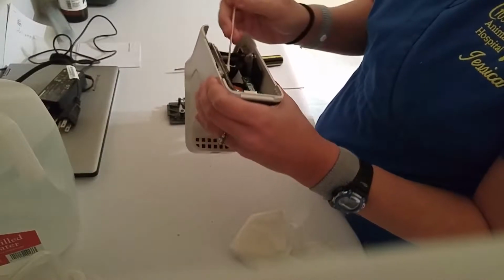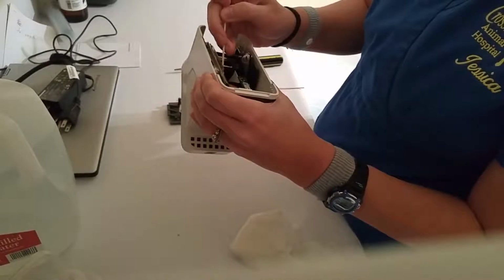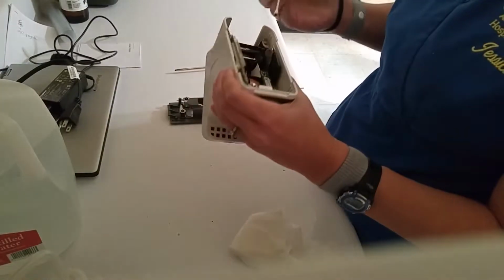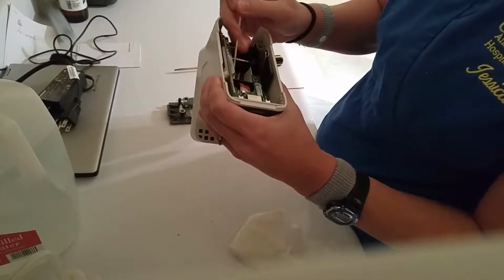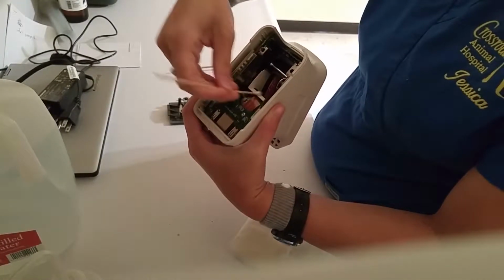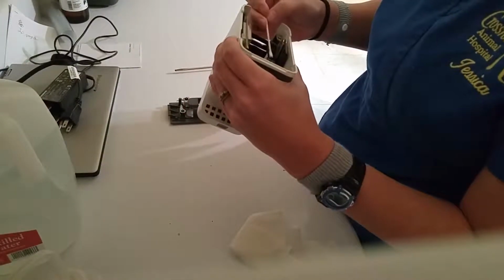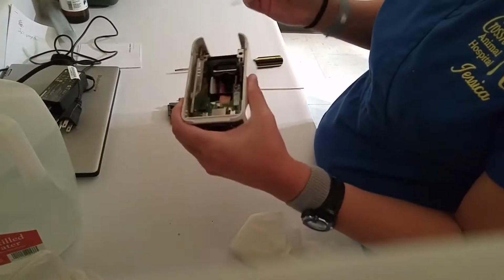Sometimes there's extra blood or blood and conjugate in the well, so it kind of snaps up to the top. So we want to make sure that's all clean. Sometimes if it builds up too much, it can drop down into the well and then we can get contaminated tests and incorrect results. Make sure everything in here is just clean.